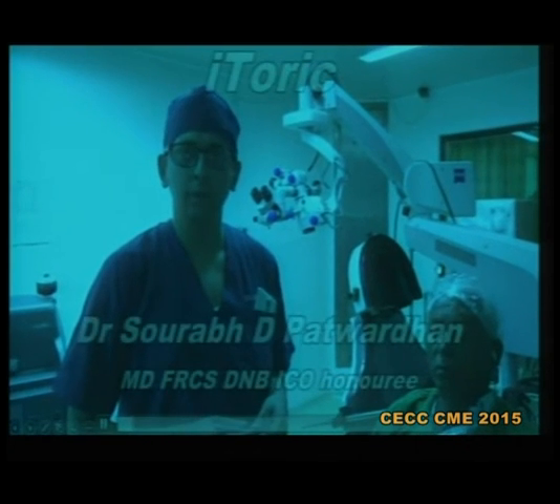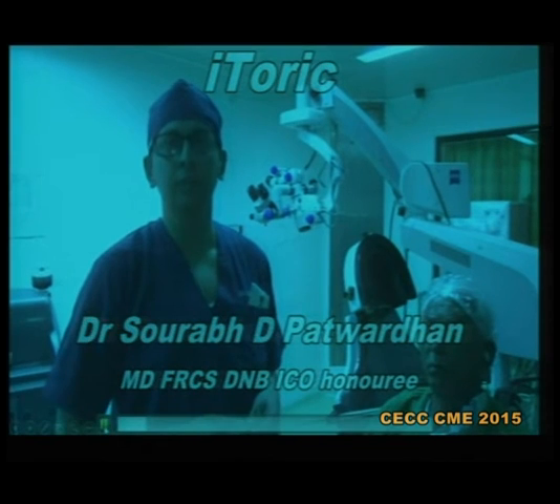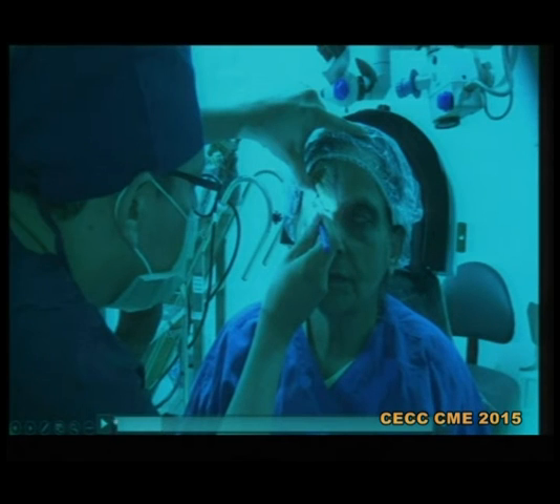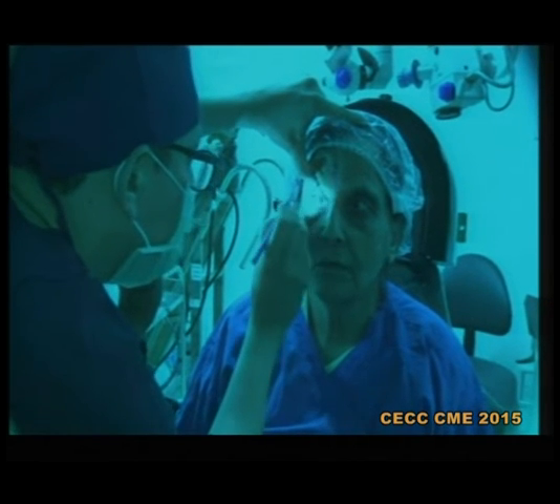The technique is very simple. I just do freehand marking. I'm going to demonstrate how to use the iToric application to check whether the marking done for placing the toric IOLs is correct or not. This is a simple freehand marking. The advantage is that the patient is usually quite cooperative, because even on slit lamp or when you are using an instrument very near to the eye, patients tend to squeeze and the eyes tend to rotate upwards. I have used this freehand marking even in children where I want to put toric IOLs.